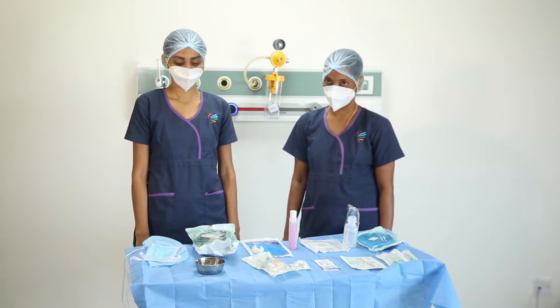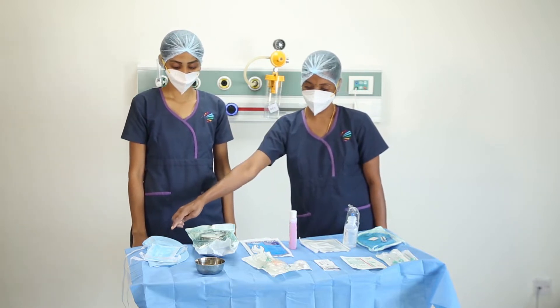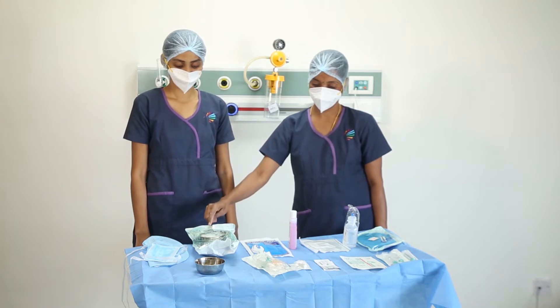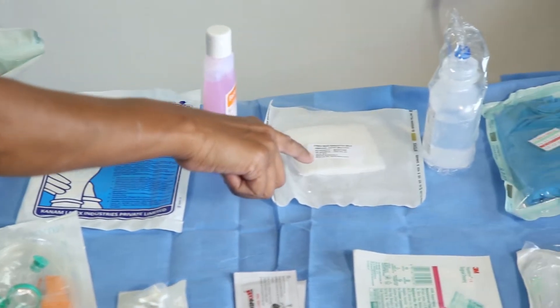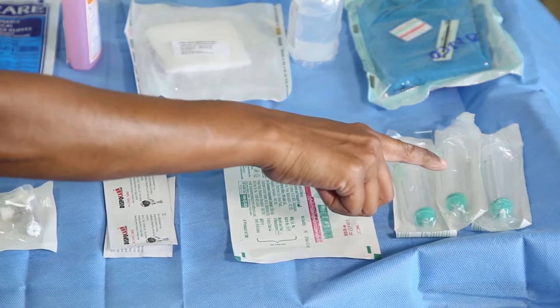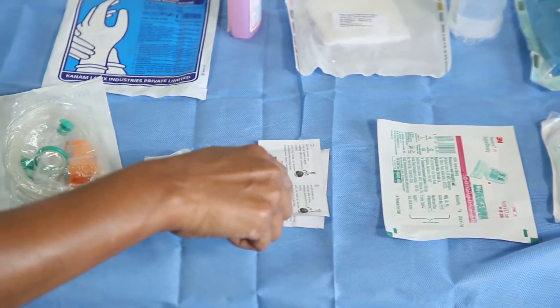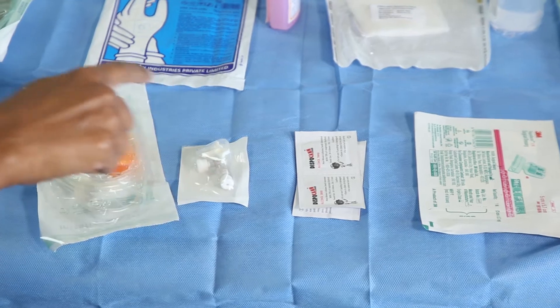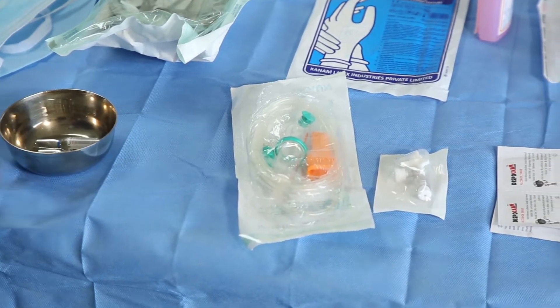In order to access a Hickman line we will need the following things: mask and cap, central venous access dressing tray, sterile gloves, chlorhexidine, sterile gauze pieces, normal saline, sterile towel, 10cc syringes, occlusive dressing like Tegaderm, alcohol swabs, 3-way stopcock, IV set, hep lock, and the desired medication to give.